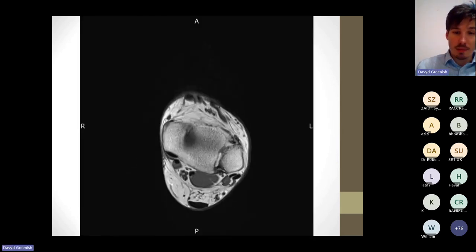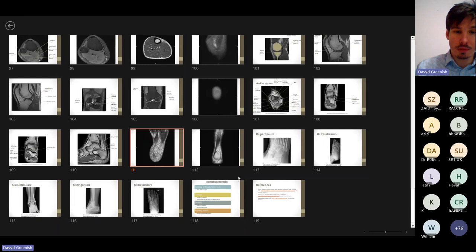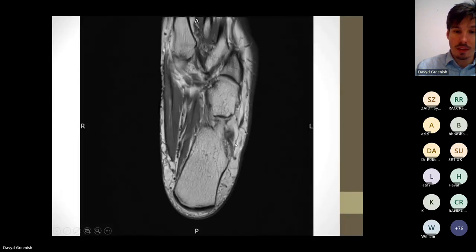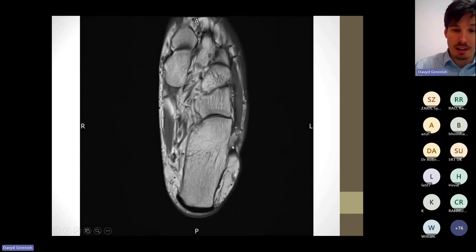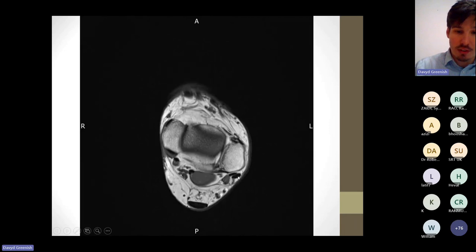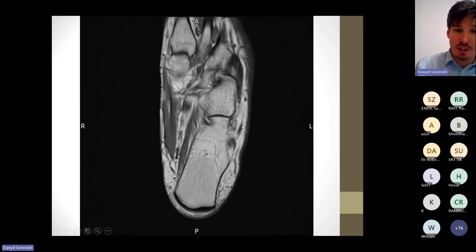This is just to very quickly demonstrate. I don't want to take up too much time here, but really quickly, we're over the lateral aspect here, posterior at the ankle. So we've got the peroneus longus and brevis. The longus is going to come underneath and wrap under the foot. It's harder to see once you've taken it on an axial plane at that level, but it's coming just posterior to it. That's what I want to demonstrate. So it's posterior to, cupping, the peroneus brevis. Peroneus brevis tendon then runs and attaches.